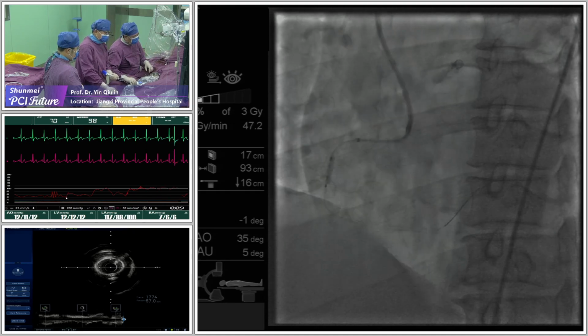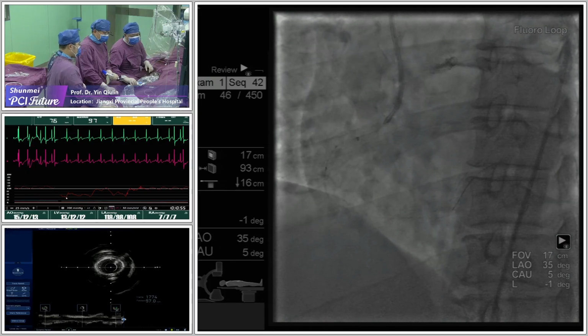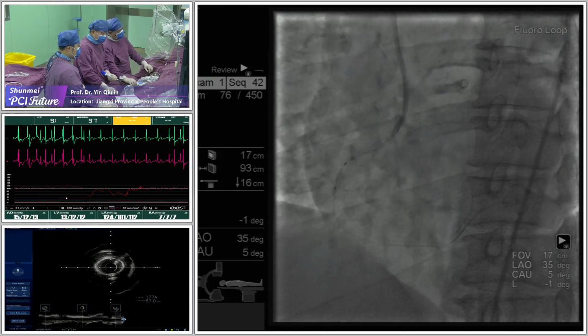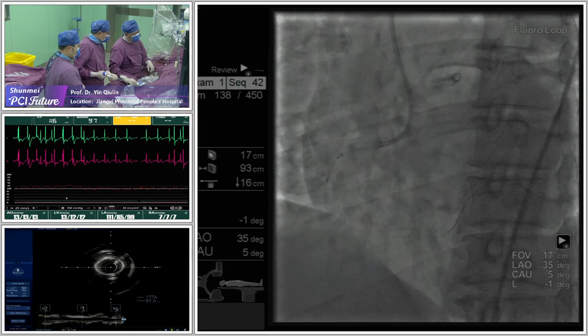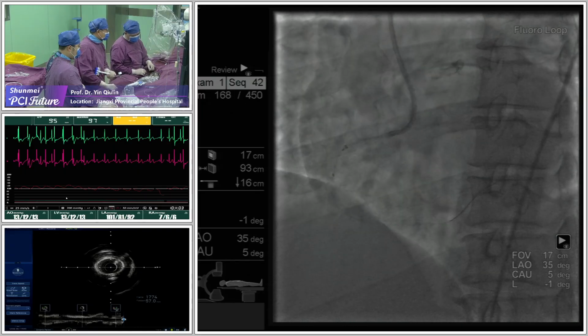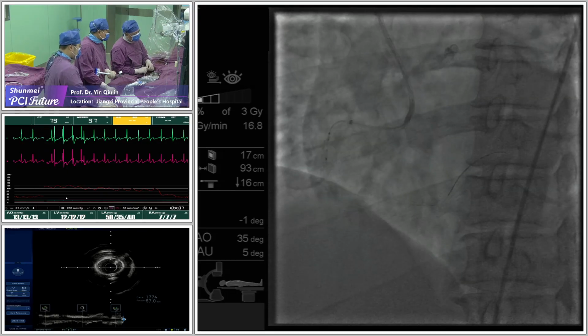那医生，我想问一下，下一步如果是冲击波做完之后，下一步的策略是什么？是用切割球囊，还是用高压球囊来预处理？What will be the next strategy Dr. Yin Qiulin will be applied? Maybe cutting balloon or the ultra high pressure balloon?